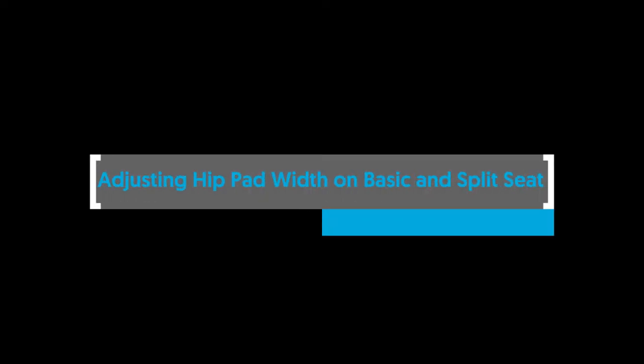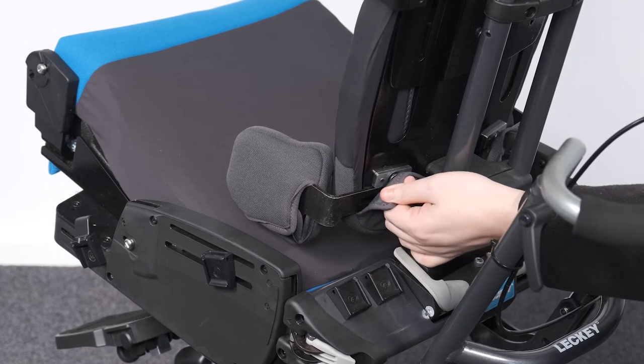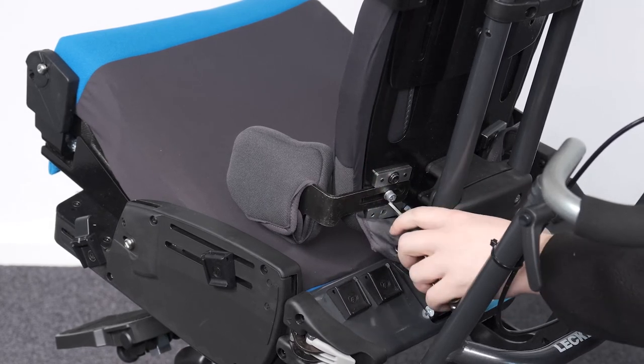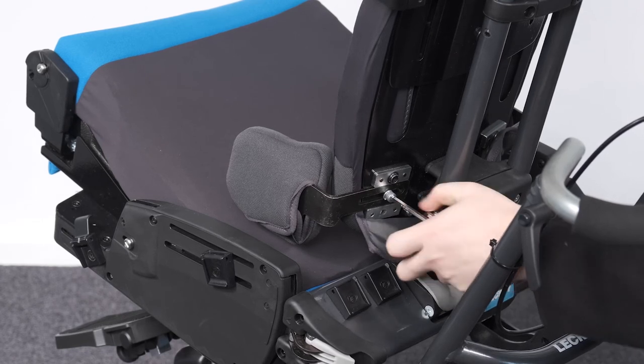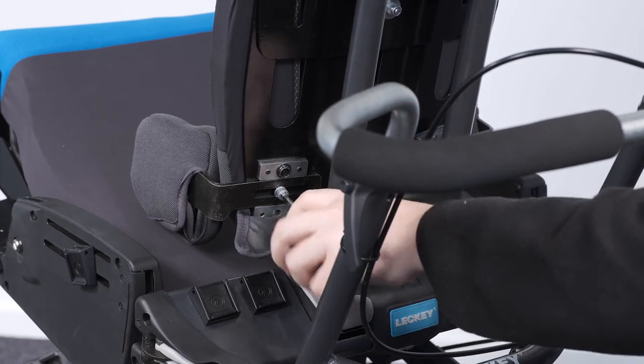Adjusting hip pad width on basic and split seat — moderate and complex backrest. To adjust the hip pad width on the moderate and complex backrest, locate the adjustment bolt at the back of the moulding. Loosen the bolt and adjust inward or outward to the desired position. Tighten the bolt to secure in place.